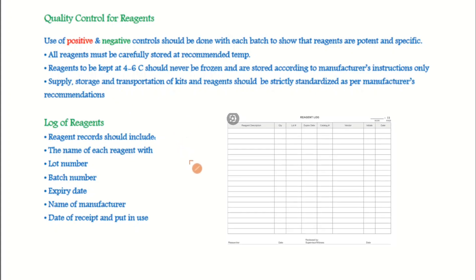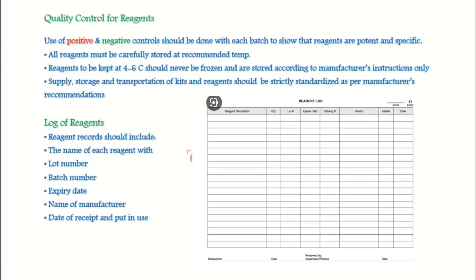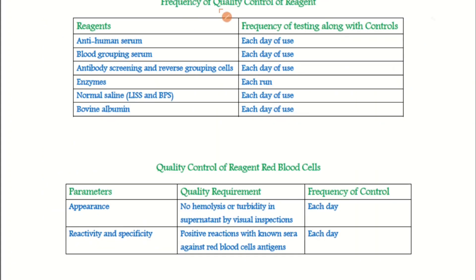Regarding reagent log sheets, the records should include the name of each reagent with lot number, batch number, expiry date, name of the manufacturer, date of receipt, and date put in use. For frequency of quality control: anti-human serum should be checked each day of use, and blood grouping serum also each day of use.